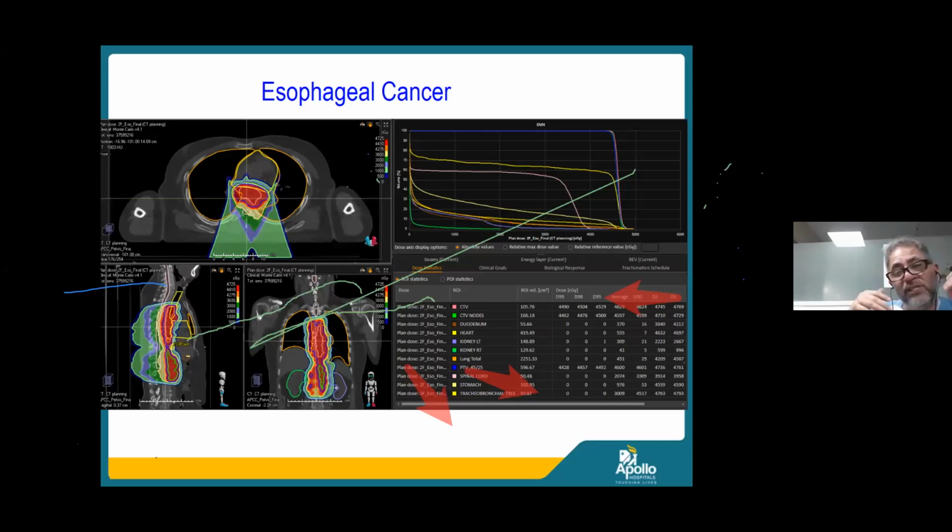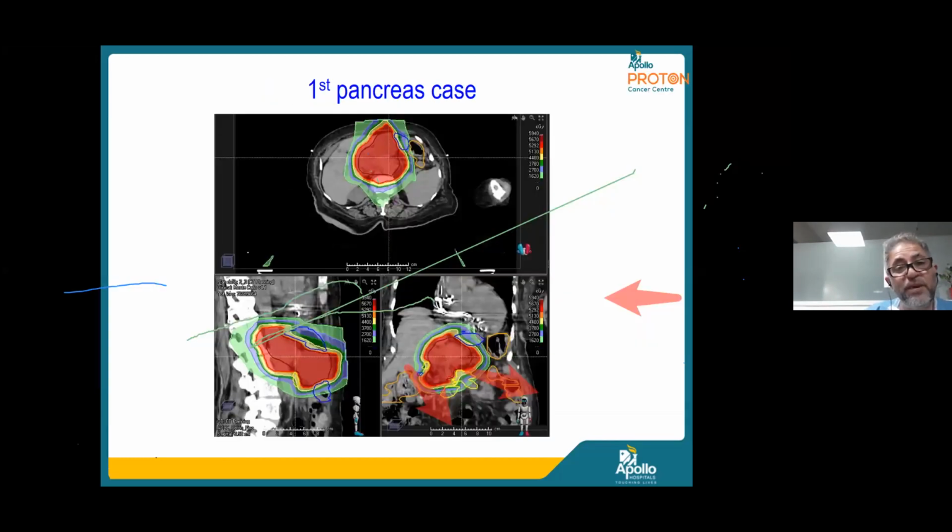The esophagus has an immunological angle to it as well, because when you treat a large beam like esophagus, the circulating blood, which can get irradiated with photon, can also irradiate a lot of lymphocytes. With the advent of the benefit of radiation to spare the lymphocytes, to give an immunological benefit to the tumor, proton therapy has been postulated to reduce the irradiation to the T lymphocytes, and can also confer to some extent not only quality of life benefit, but also potentially a survival benefit. And this is being tested in many sites.